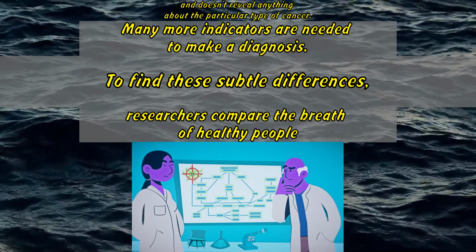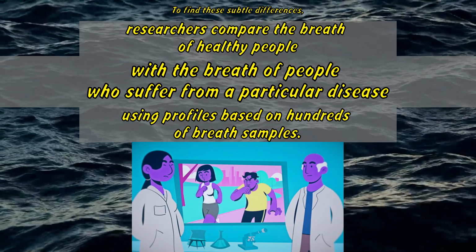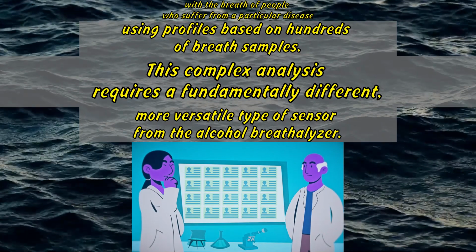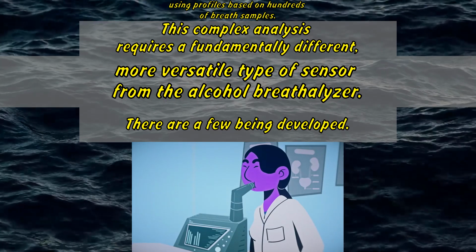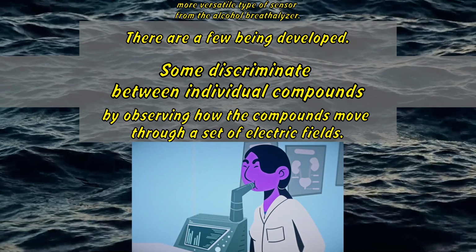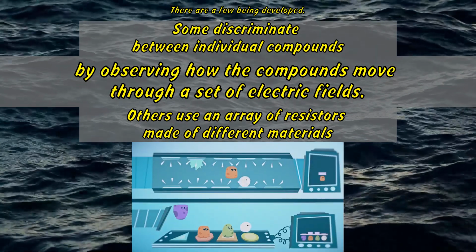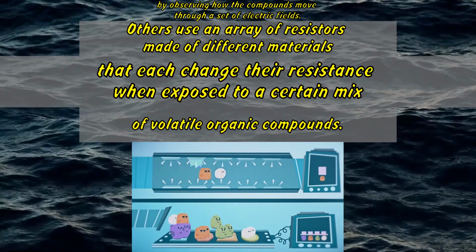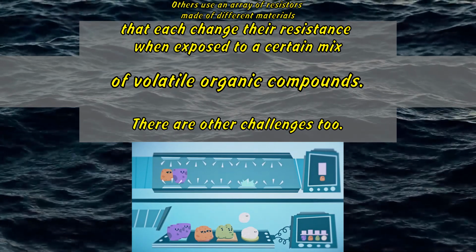To find these subtle differences, researchers compare the breath of healthy people with the breath of people who suffer from a particular disease, using profiles based on hundreds of breath samples. This complex analysis requires a fundamentally different, more versatile type of sensor from the alcohol breathalyzer. There are a few being developed. Some discriminate between individual compounds by observing how the compounds move through a set of electric fields. Others use an array of resistors made of different materials that each change their resistance when exposed to a certain mix of volatile organic compounds.